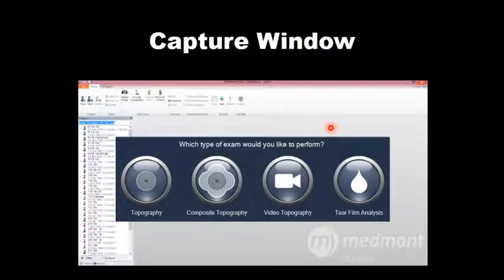Now, for this particular patient, scleral makes the most sense because we saw the elevation differential at about 600 microns. So this particular eye had a change in elevation that was far beyond what a corneal GP could manage. When we place this patient into a scleral, we clear over top of all that irregularity. We land the lens way out on the conjunctiva where this eye is relatively symmetric. Then we're able to create the landing that we desire, but the appropriate vault with the cornea.